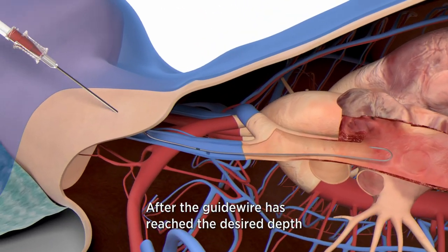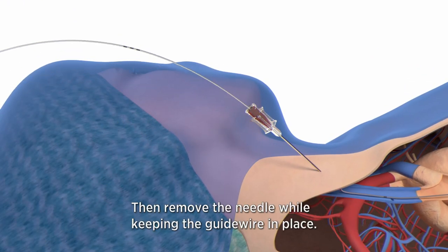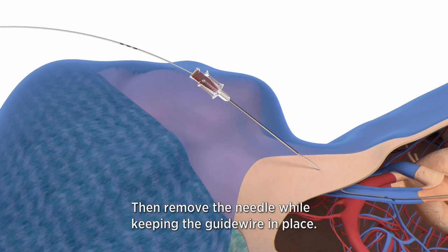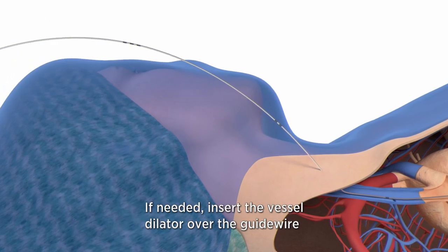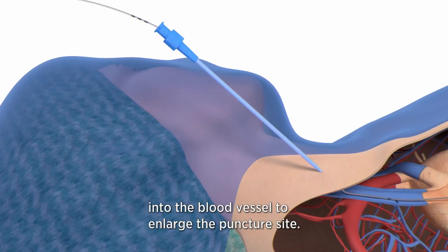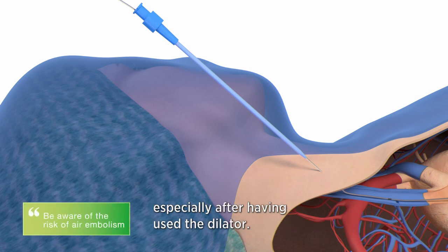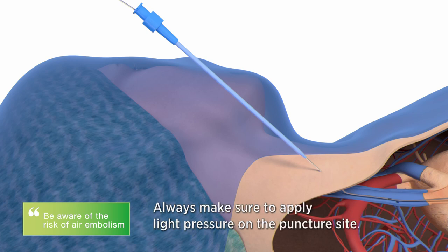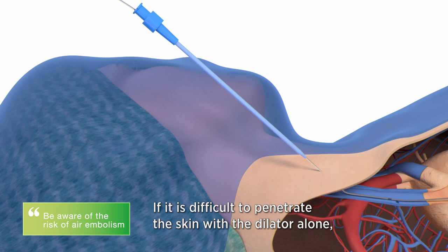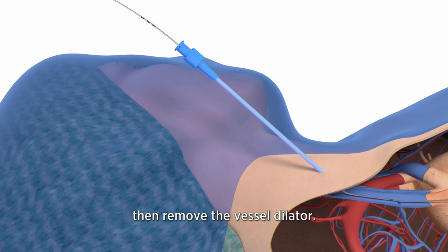After the guide wire has reached the desired depth, remove the guide wire dispenser, then remove the needle while keeping the guide wire in place. If needed, insert the vessel dilator over the guide wire into the blood vessel to enlarge the puncture site. There is a risk of air embolism, especially after using the dilator, so always make sure to apply light pressure on the puncture site. If it is difficult to penetrate the skin with the dilator alone, use the scalpel. Then remove the vessel dilator.